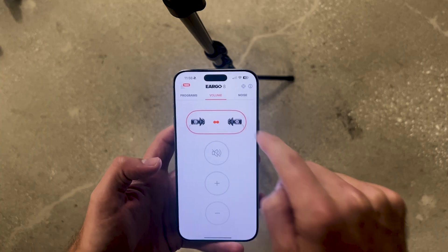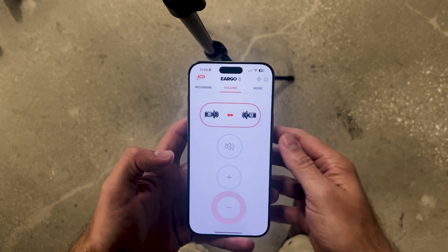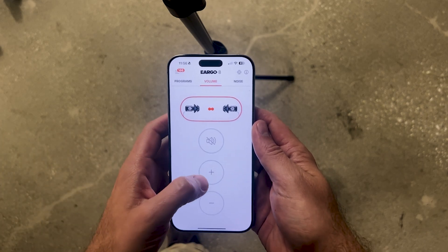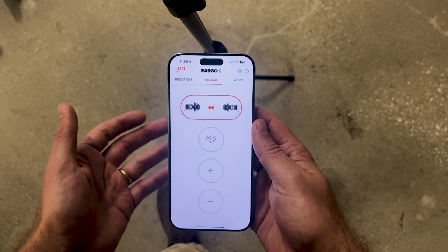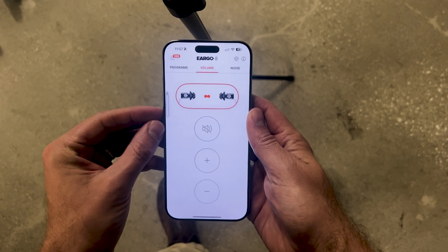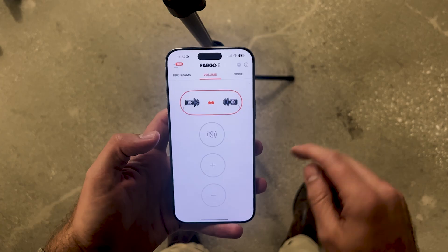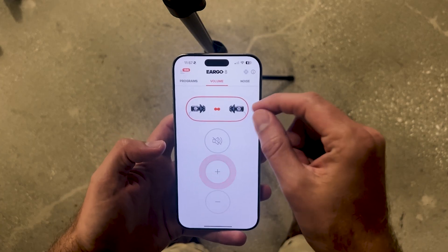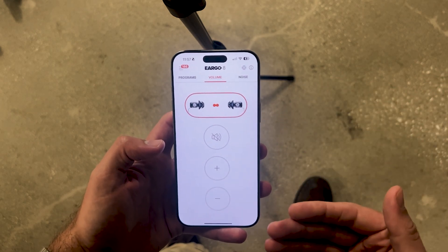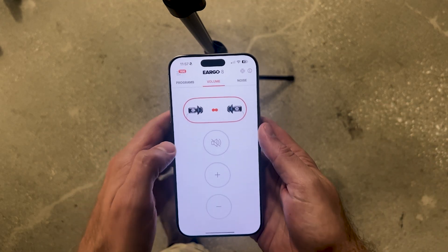There are three main tabs in the app. The first one is volume — hit the plus sign to increase the volume, hit the minus sign to decrease it. It's worth noting that these devices are not controlled through Bluetooth; they actually use a quiet, high-frequency signal that goes up to the devices and tells them what to do. Because of that, you'll want to make sure your phone's volume is at least at 60% so that your hearing aids can hear the phone making noise. You can only change the volume by about five clicks down and five clicks up before you hear min or max.